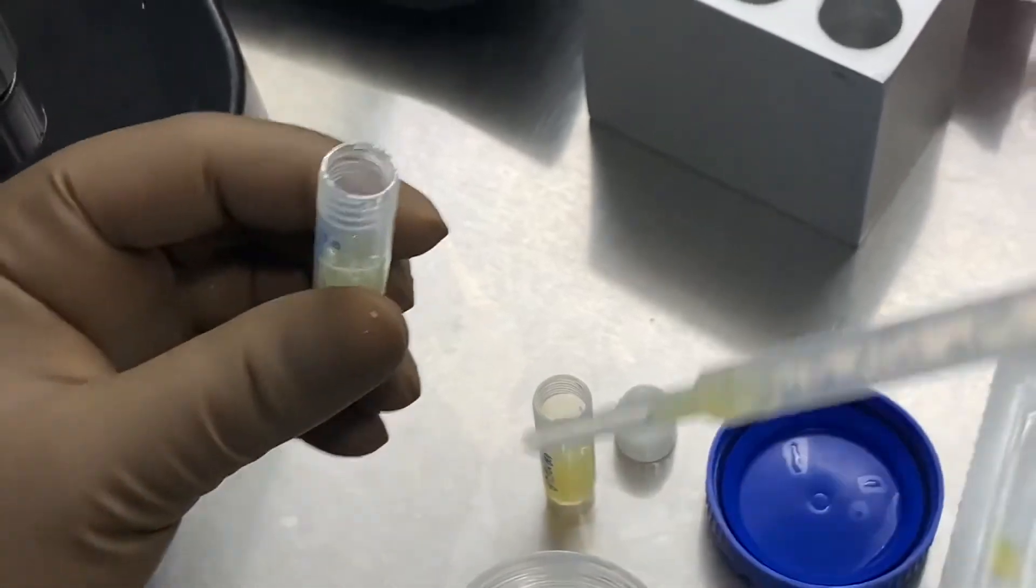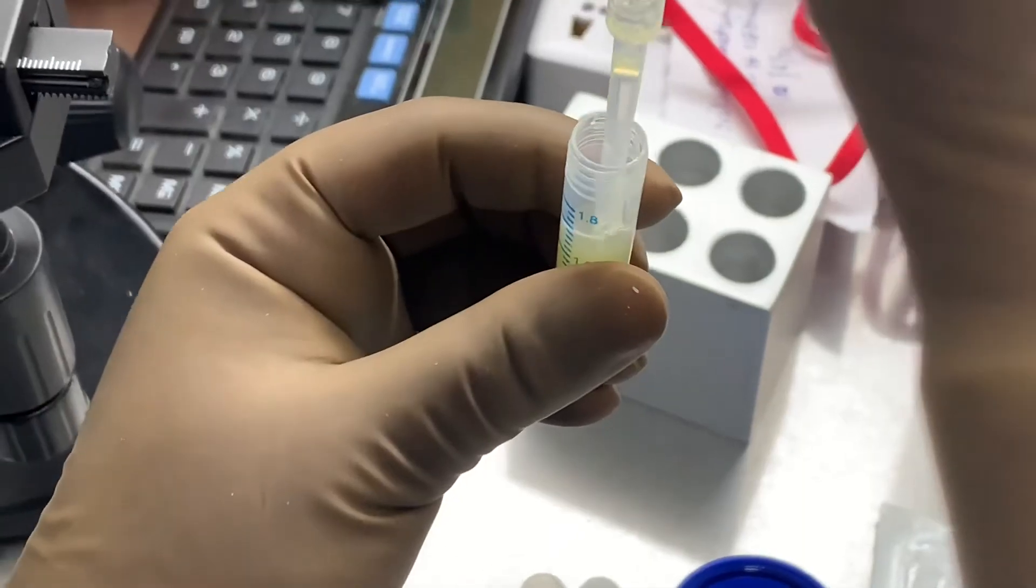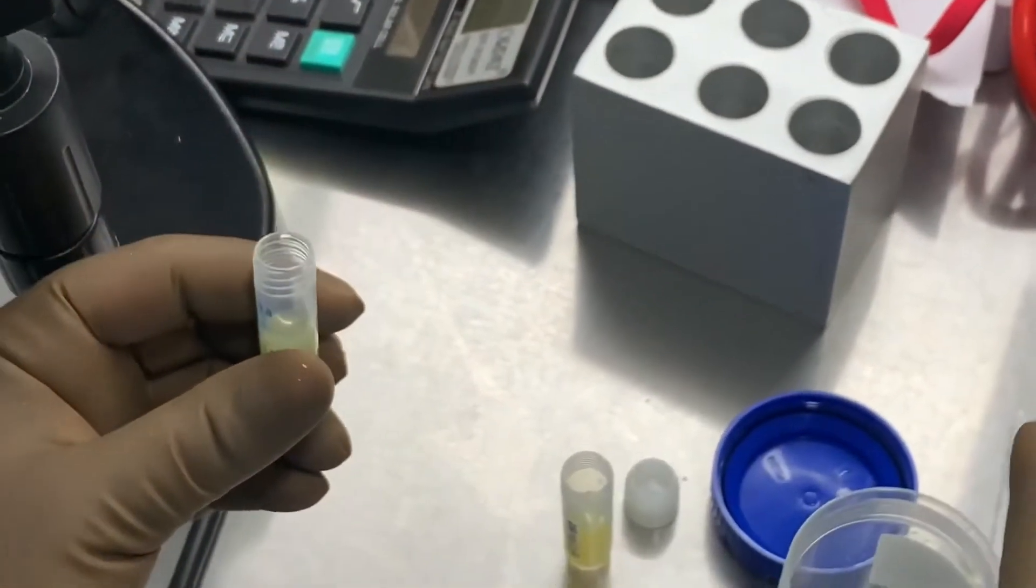So what we need to do is keep the semen with cryoprotectant, this particular mixture inside this cryovial in room temperature for 10 minutes.